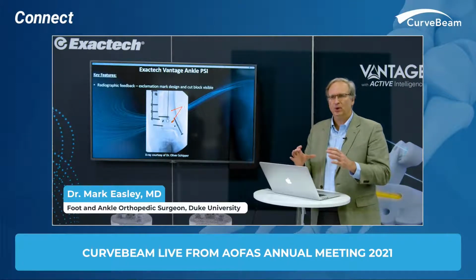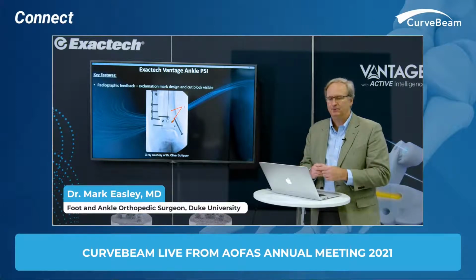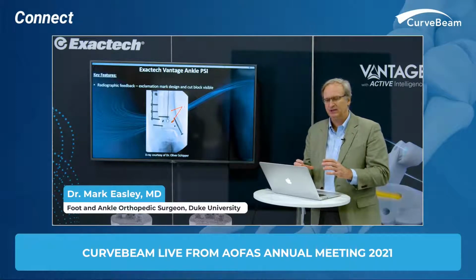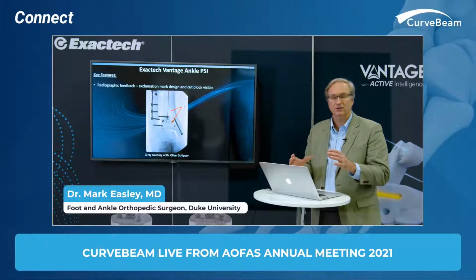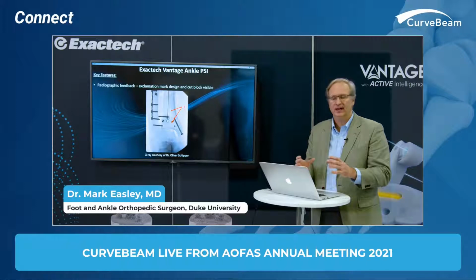It's not a big, bulky metal block that the 3D Systems team made for us. It's a block that you can see through. So you can see I have some pins in place. There's some hardware that's there that I can easily work around. I can plan that too. If there's hardware that's going to be in the way, I know exactly where the need would be to remove that to make it fit.